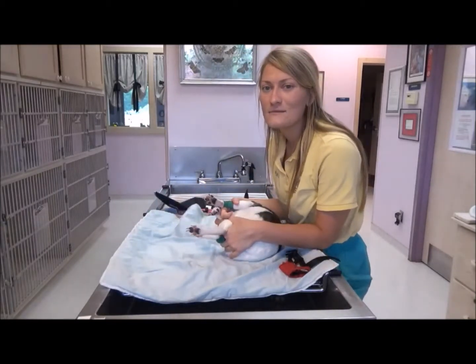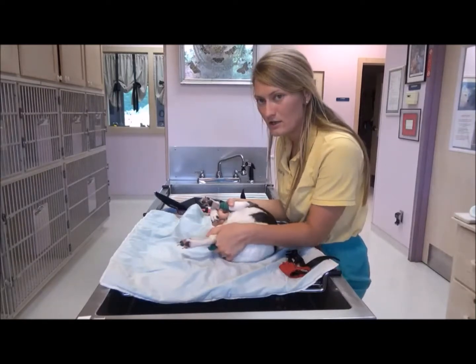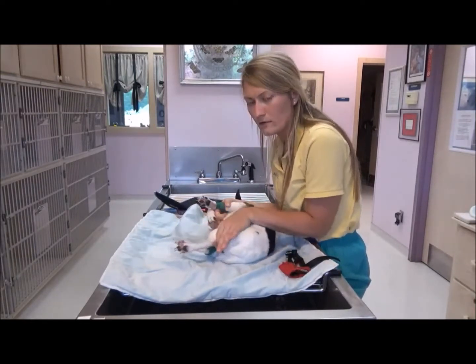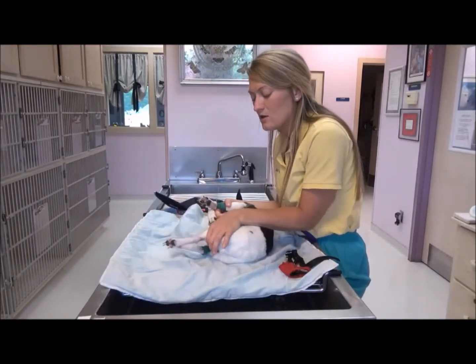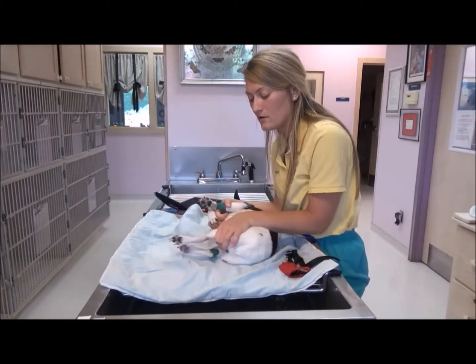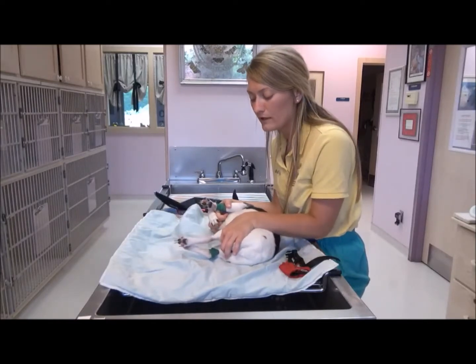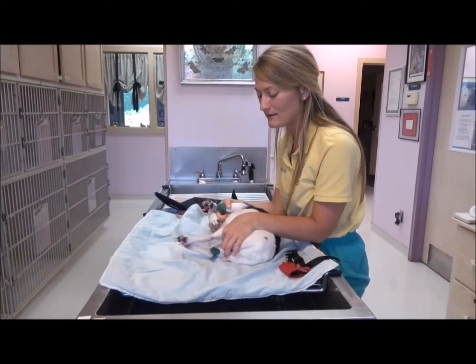For a saphenous blood draw, you want to have your patient in lateral recumbency, and then you want to hold on the leg where the blood sample is being collected just below the knee and hold the skin tight so that way you keep the vein from rolling, and that helps the person collecting the blood sample.